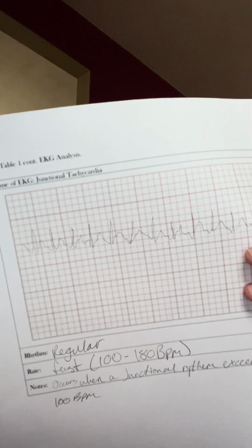These are all smushed together too, compared to this one, where it's just kind of spaced out a little bit. And then I'm going to do my ventricular fibrillation. It's kind of just a bunch of little bumps.